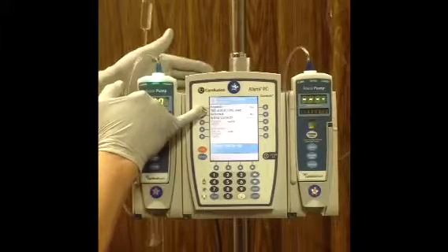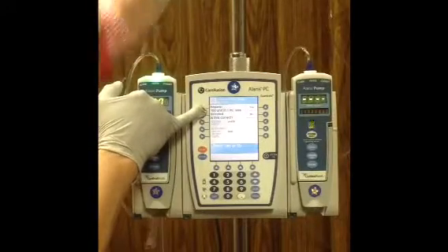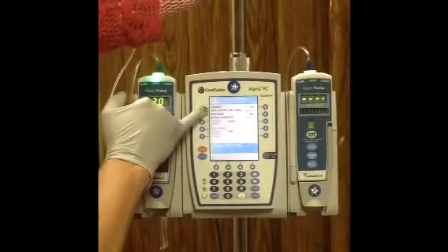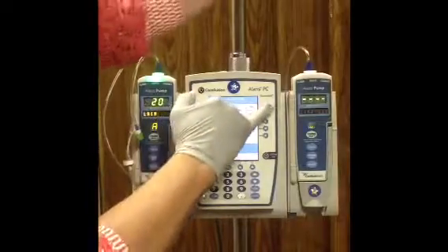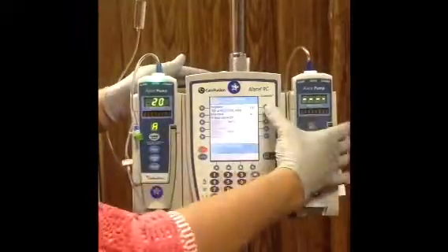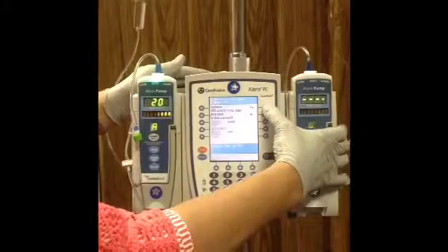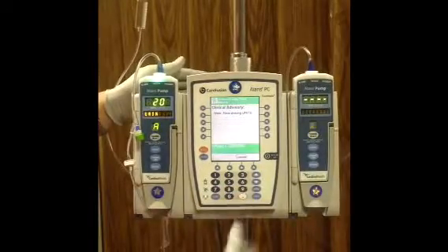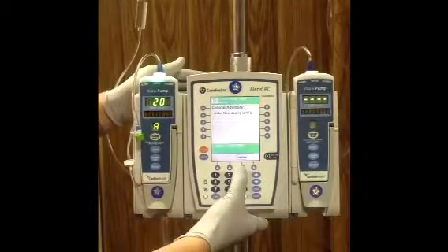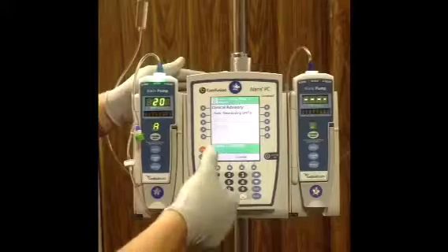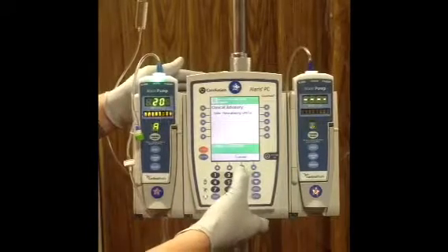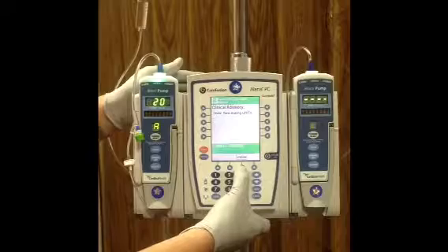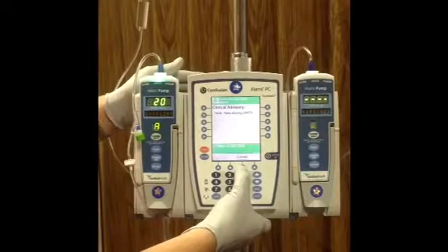Here we're just at a confirmation screen where we want to be sure that we have the correct concentration. You would want to compare it to what you're seeing on the bag and also what's written in the order. Select yes. Please note that this is just a clinical advisory that our pumps have recently been updated, so make note of that and go ahead and hit confirm.